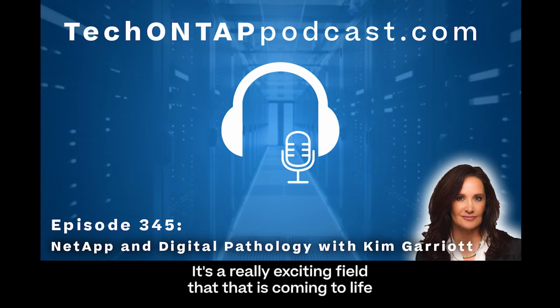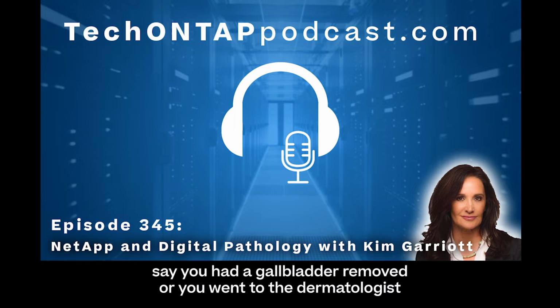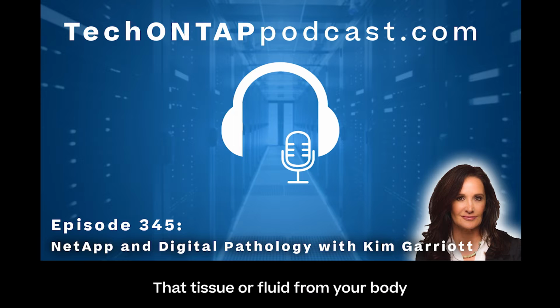Yeah, exactly. It's a really exciting field that is coming to life in healthcare and life sciences. Many of us have had some interaction with pathology. Any kind of tissue removed from your body, say you had a gallbladder removed, or you went to the dermatologist because there's a little mole or a bump on your arm, and they do a little biopsy sample of that tissue or fluid from your body, it is set on a glass slide.